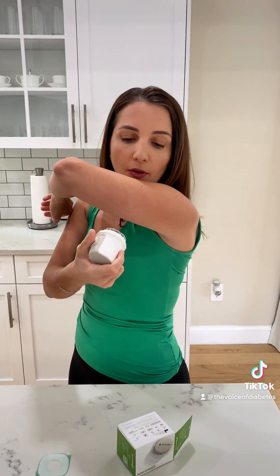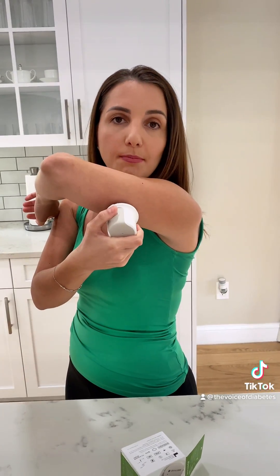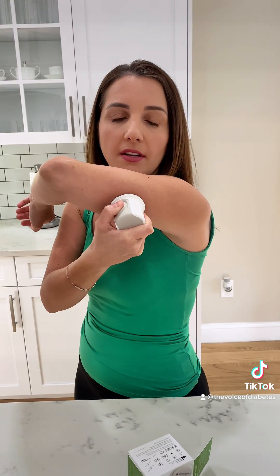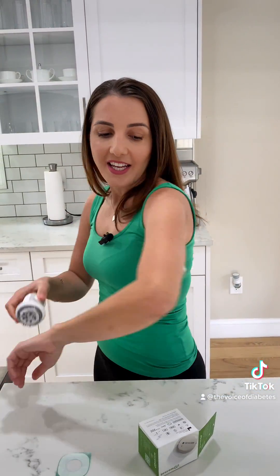You want to keep that intact, and all you're going to do is go to the site that you want to insert it. Make sure it's a good area, and all you do is press the button — and there is my G7. It also comes with an overpatch.